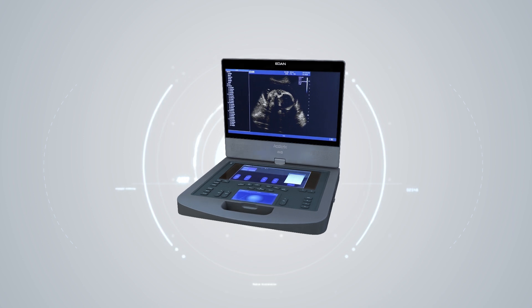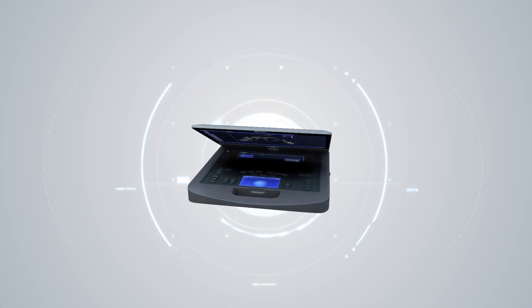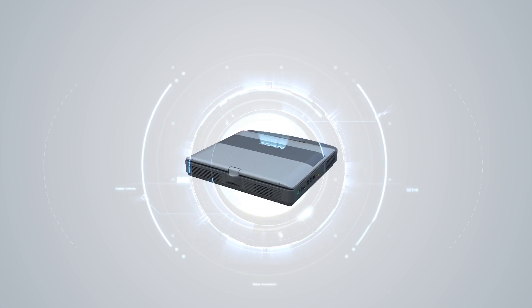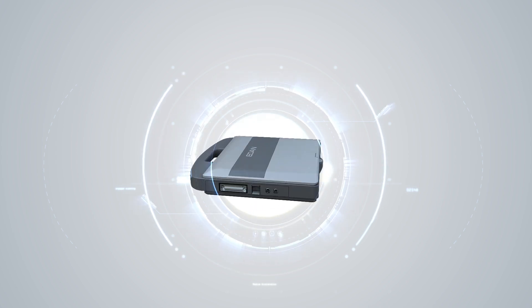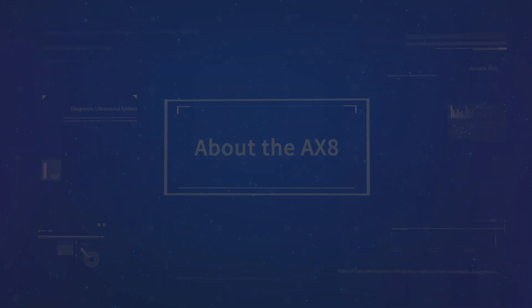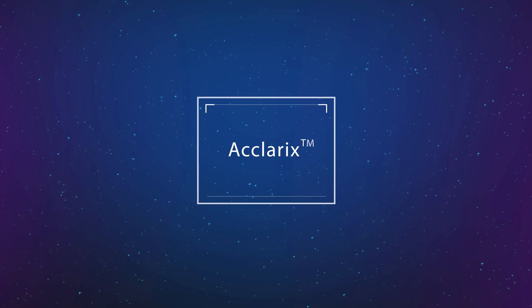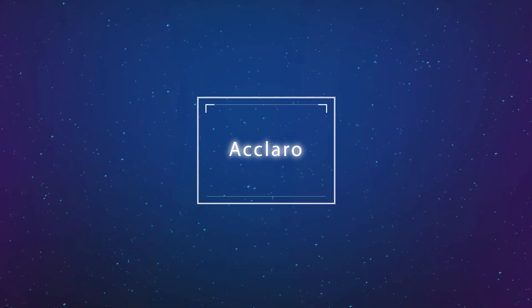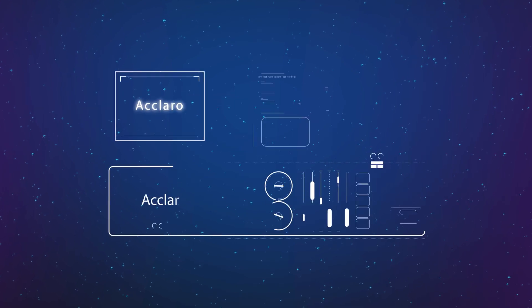Welcome to the Acclarix AX8, EDAN's Premium Performance Compact Portable Ultrasound System. Acclarix comes from the Italian word 'Acclaro,' meaning to make clear.